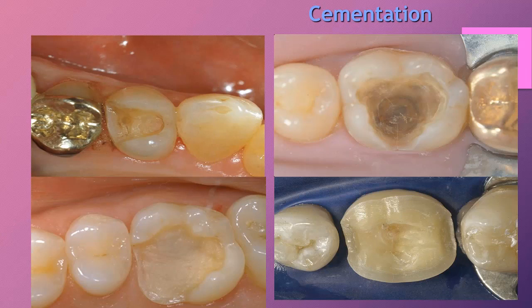So you have an option on these to utilize a product that has great adhesion capabilities to hold the tooth together, or you could use a different product that actually has the ability to help mend the tooth and doesn't require as much adhesion to hold things in place. You decide what it is you want to implement, but nonetheless, you can start to see that based on preparation design, we have different options of adhesive capabilities or bioceramic cements, bioactive cements to implement.